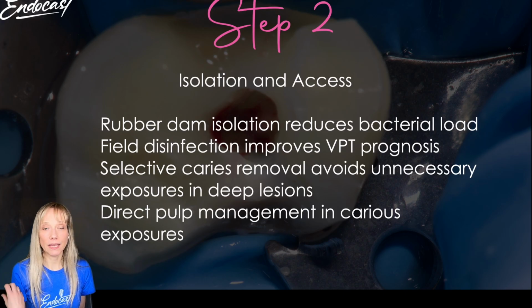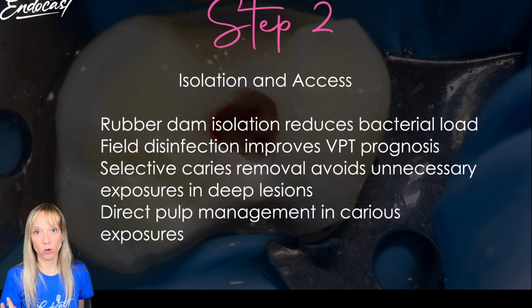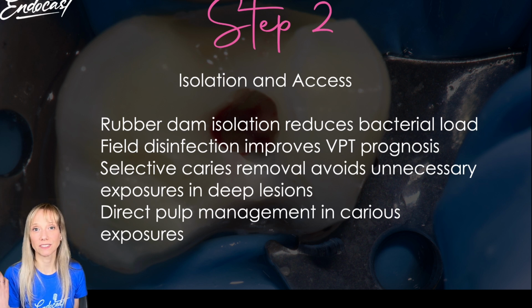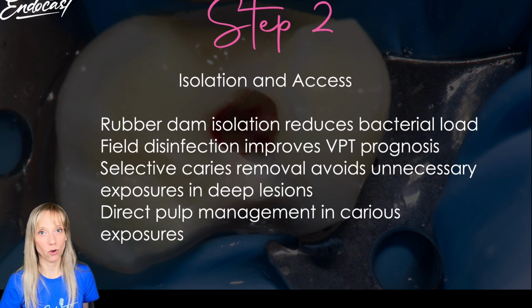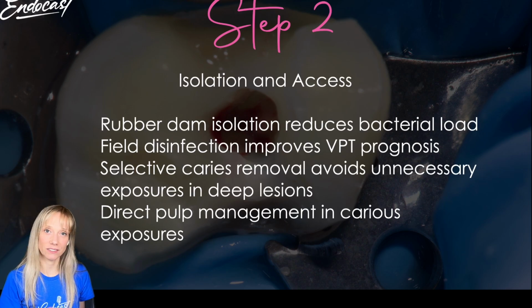And then remove the decay, because you have to remove the reason for the inflammation. So you have to remove the bacteria. And now there might be some controversy in how much of the tissue you have to remove, because some schools will tell you to remove all the infected and affected tissue.